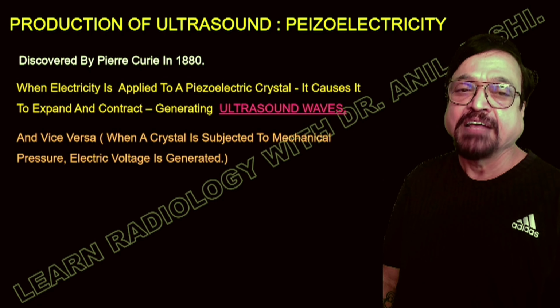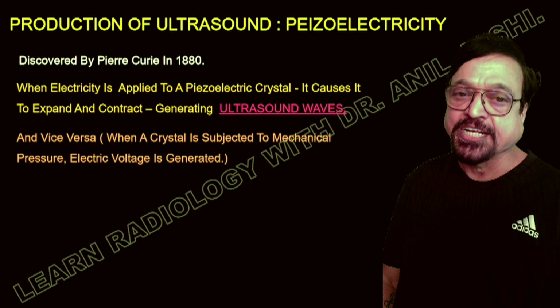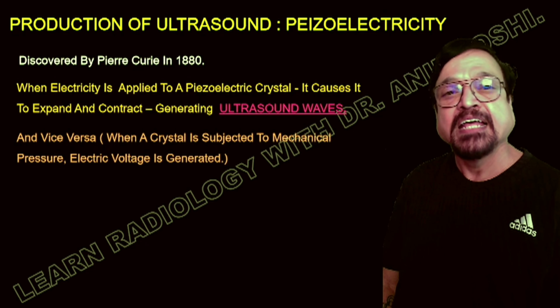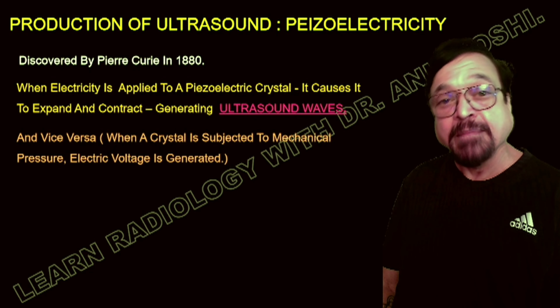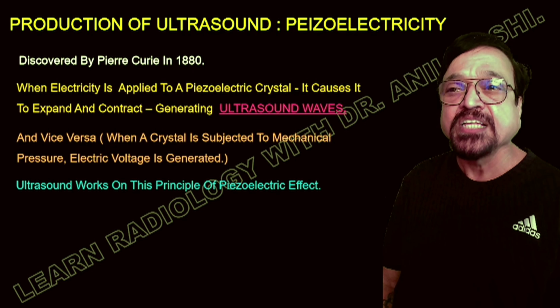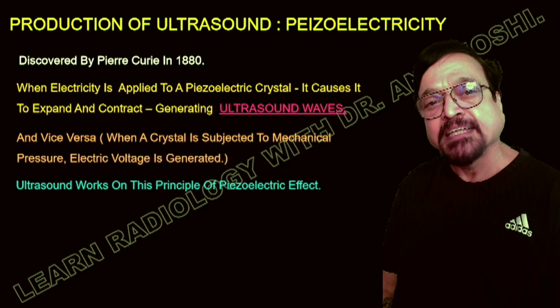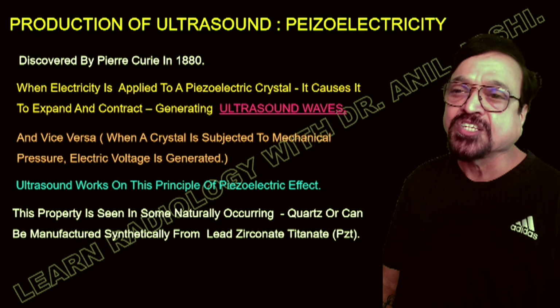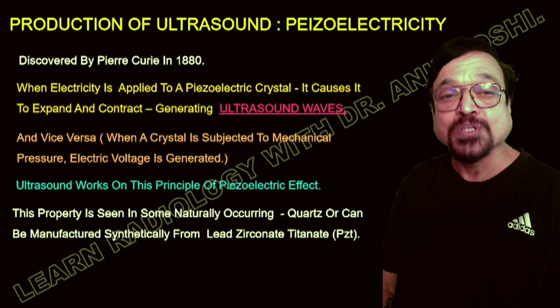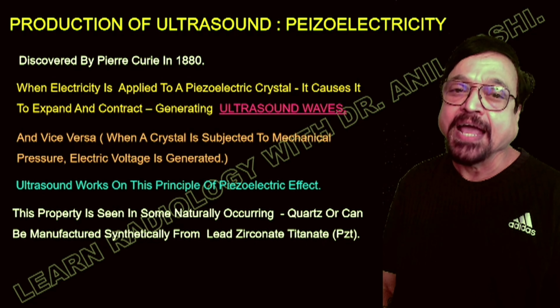What it means is, when an ultrasound wave is applied to it, it again sets it into vibration, and that causes another set of signals which are sent back to the monitor, and this is directly proportional to the ultrasound waves coming back. This is the vice versa, the direct piezoelectric effect. What is the basic principle of ultrasound study, ultrasound machines, ultrasound diagnosis? So it is very important, and all the crystals do not have this property.